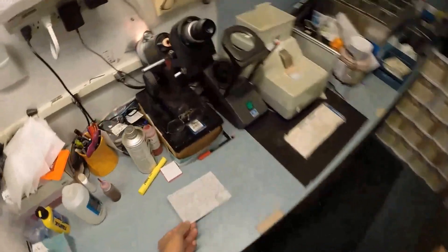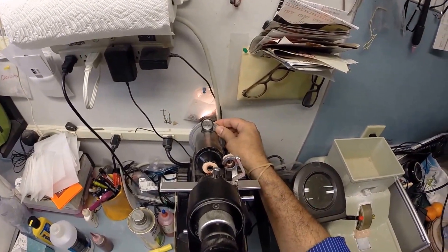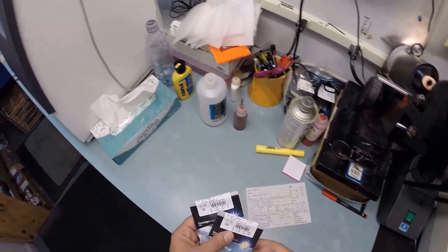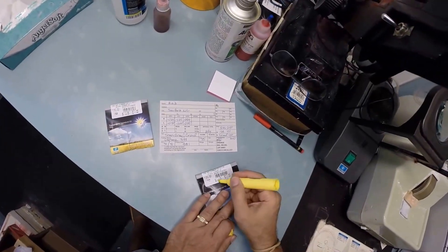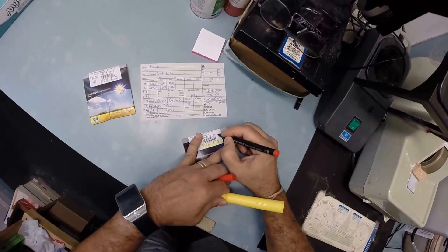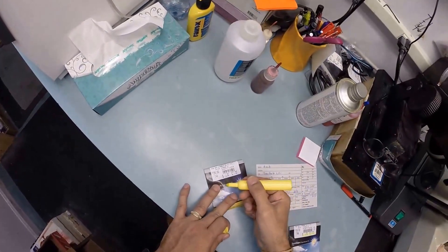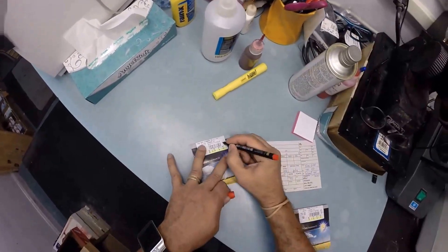I'm going to come down here to my Marco 101 lensometer. I'm going to spin the axis wheel to 99. Your right eye reads minus a quarter, minus one and a quarter at 99. Let me go ahead and mark this one - this will be your right eye. And minus 50, minus 100 at 55 for your left. Minus 50, minus one for your left eye.